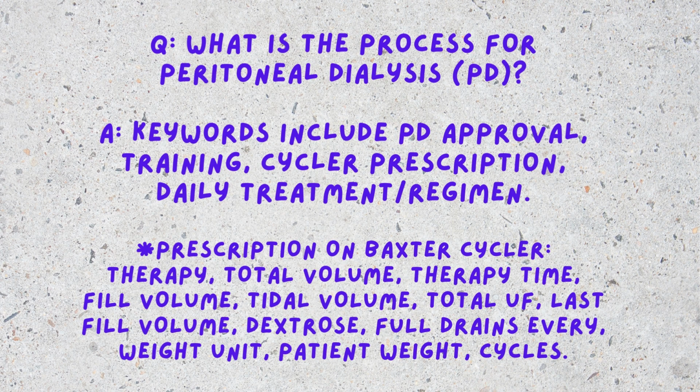While that catheter is healing up, you will still continue going to hemodialysis, and then you are going to undertake a training period with the peritoneal dialysis nurse. So you will be assigned a peritoneal dialysis nurse who will be your first point of contact for training and also for your monthly clinic visits. You will also have a team of a dietitian. You will also have a social worker, and then you will also continue seeing your nephrologist.